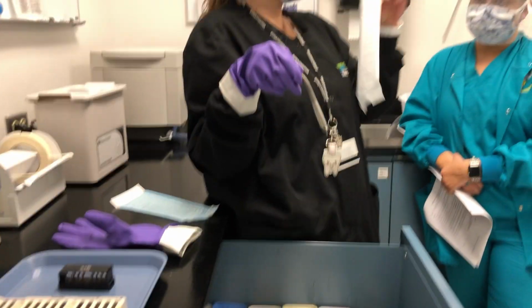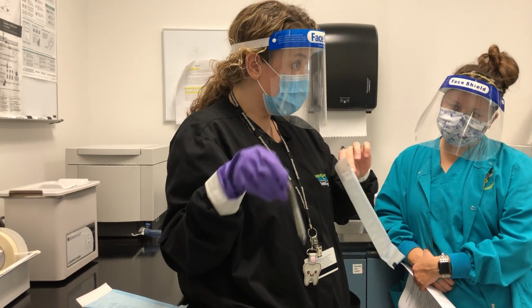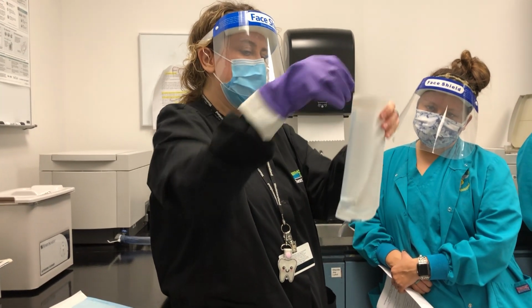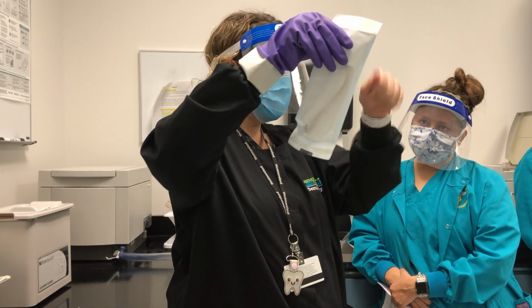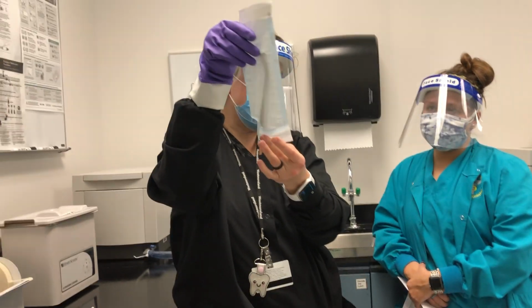And there is a little trick to handpieces. If you work in an office, you will love when somebody bags them with the tubing where you would connect your tubing facing down. And the reason for that is when they open it from the bottom, they can go ahead and set it right on the chamber without taking it all apart and then turn it onto the tubing. So it's a whole lot easier if you bag it this way, okay?